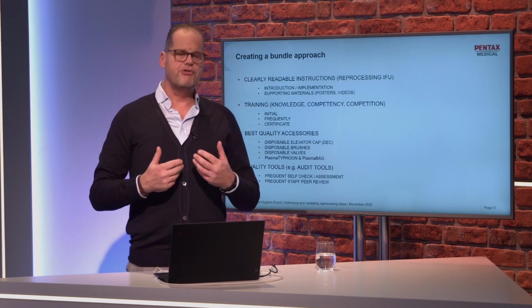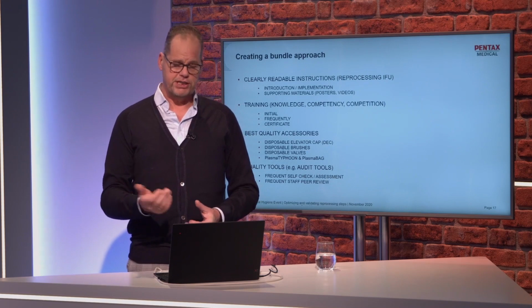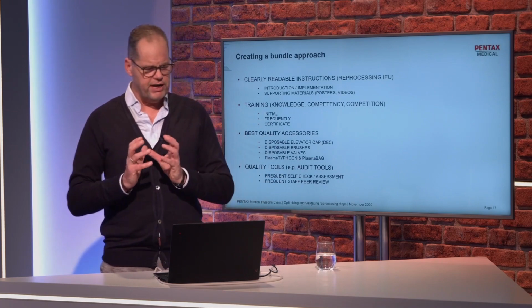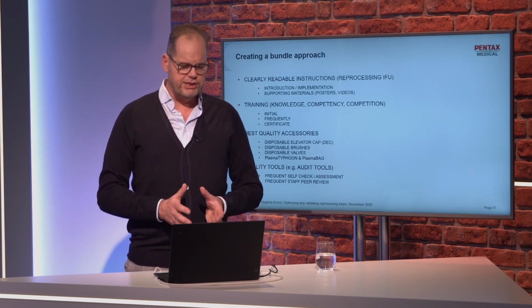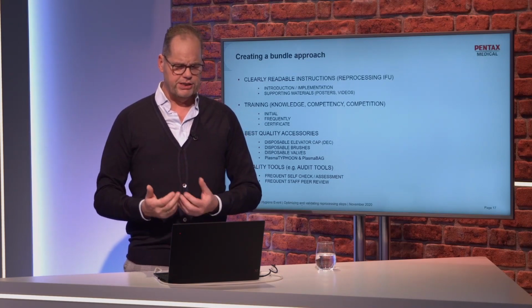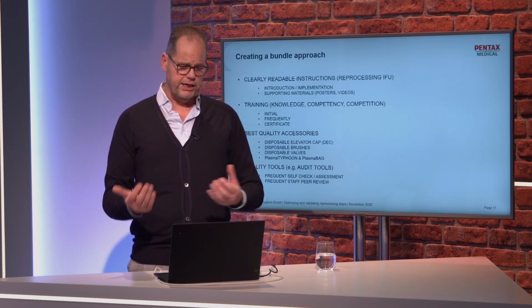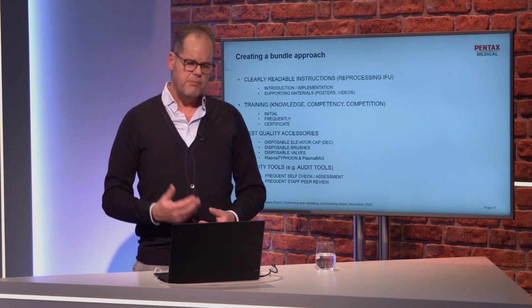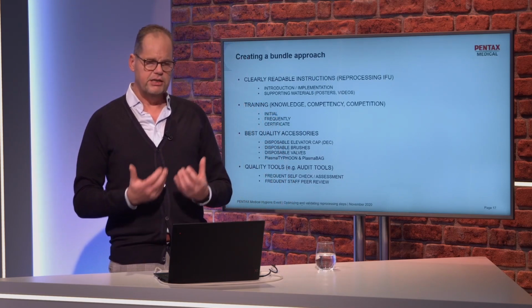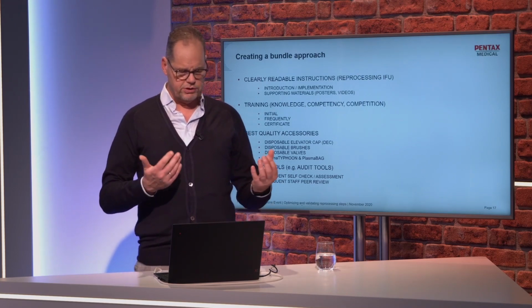And we will do that by creating a bundle approach with clearly readable instructions, the reprocessing IFU, but also with the introduction of them, the implementation, which is very, very important. The supporting materials, the posters, the videos, also the training. We have to improve the knowledge, the competency and the compliance. Initially, when you are starting in reprocessing, you have to do the course, the education, but also frequently. After 1 or 2 years, you have to prove you are still competent to do the reprocessing. And of course, there should be a certificate with points and so on.